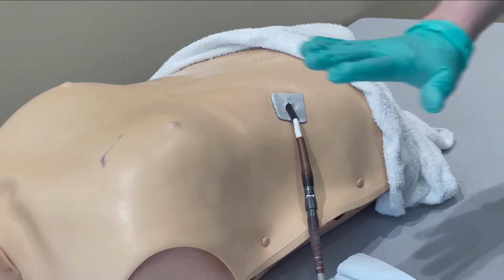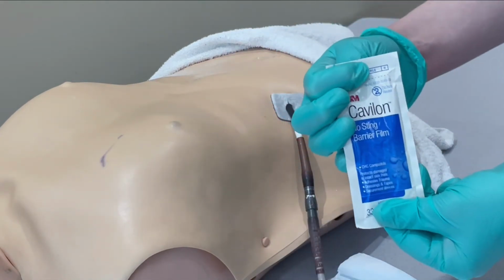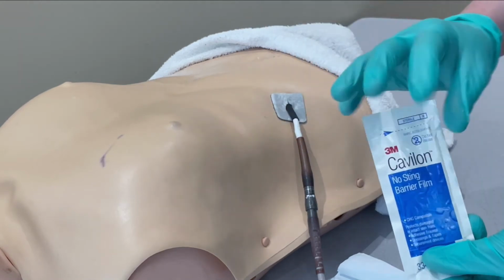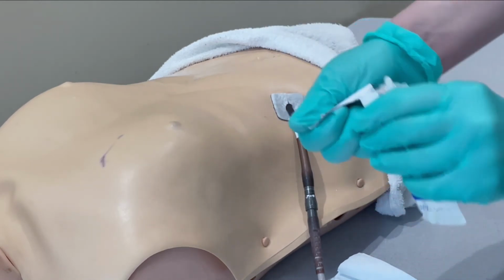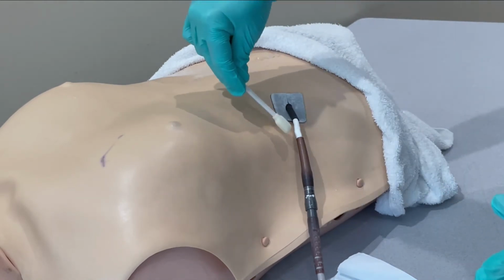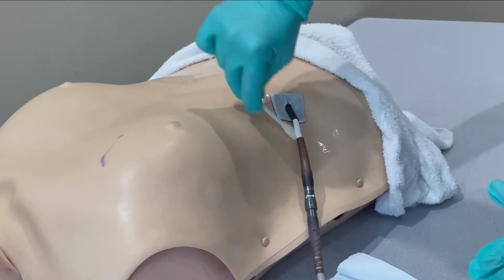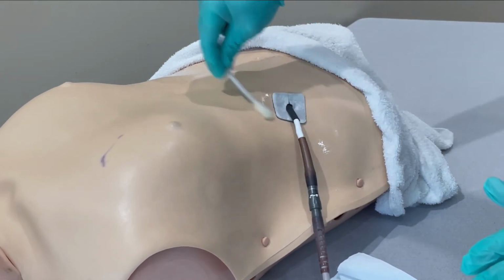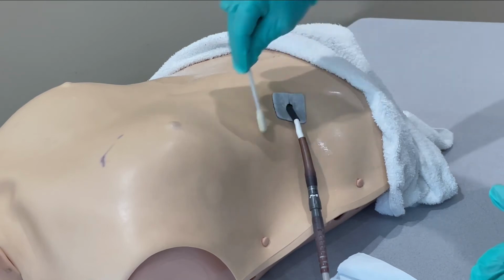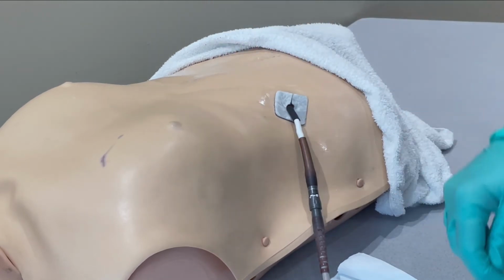Now we want to make sure everything's dried, and then we can move on to our skin prep. That's the one that's going to help stick the dressing and protect the skin. You open up this lollipop, and this is going to go around where the tape's going to touch. So about a couple inches around the exit site. Now that is going to settle in.